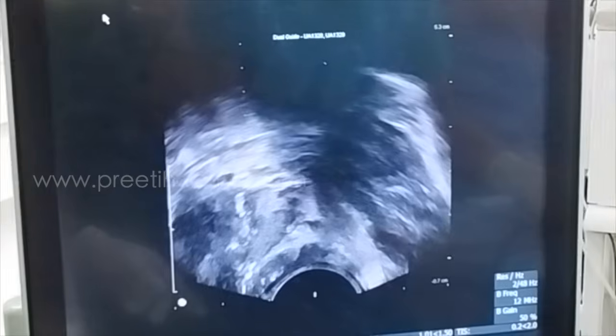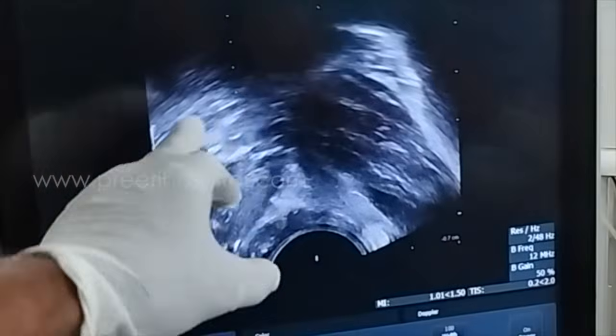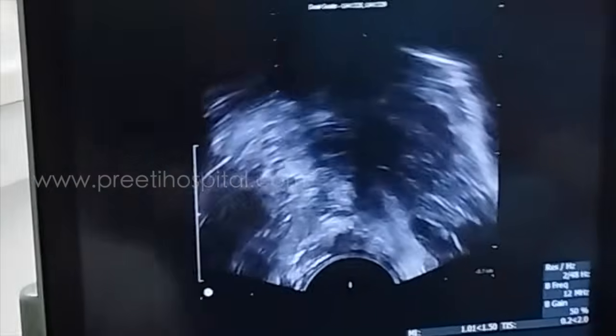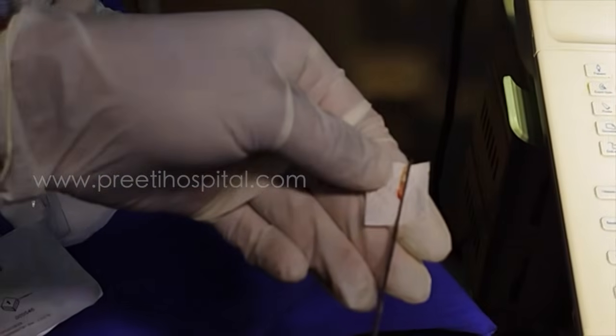Patient will have a little bit of pain. Extreme lateral. The entire thing is peripheral zone here. Now the mucosa is coming and hitting, and the peripheral part has come. Now what are the other areas you wanted to take? Right side base.